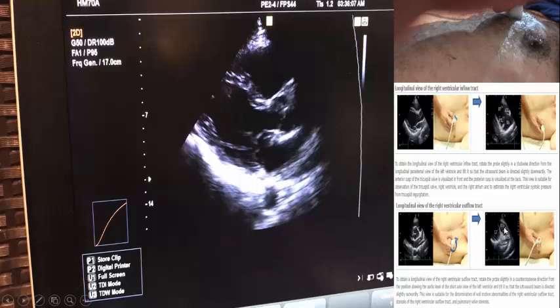The pulmonary artery flow, you can use it to get the pulmonary artery outflow tract VTI, velocity time integral, to measure the stroke volume, and you can diagnose pulmonary regurgitation very easily from this view. And by applying the pulsed wave Doppler to the pulmonary regurgitation, you can very easily measure the mean pulmonary artery pressure and the diastolic pulmonary artery pressure. Let us see how easy it is to do this view and what information you can collect from these unusual views.